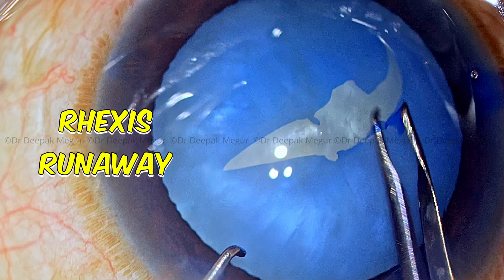Then typically we go ahead and decompress the bag. This ensures that all the swollen lens cortex, which is actually responsible for the tense anterior capsule, is taken care of, and then the chamber is refilled with OVD. A tangential cut is given with the micro scissors and the secondary rhexis is performed, which is very well controlled, and the desired well-centered and appropriately sized rhexis can be very well achieved.